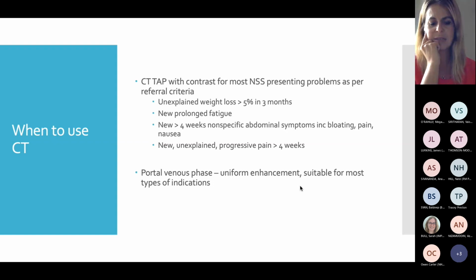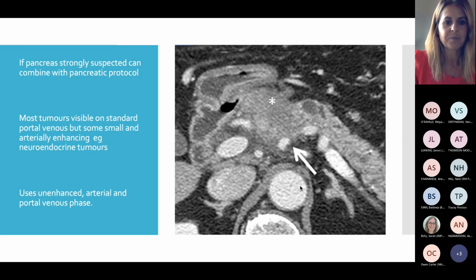What this means is that after the contrast is injected, the scan is performed approximately 65 to 70 seconds later, and that allows time for all of the solid organs and the non-solid organs to enhance, and basically that allows visibility for almost all types of tumours that you will be looking for on the non-site specific pathway. So that is the main workhorse, and I'm sure you're well aware of that.